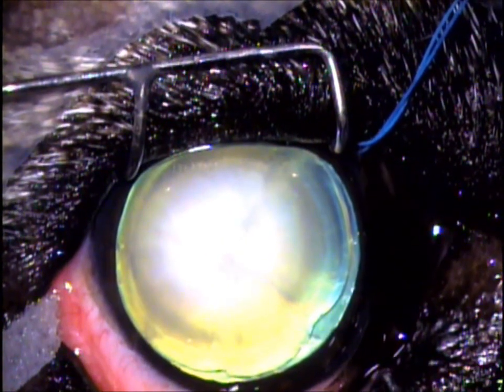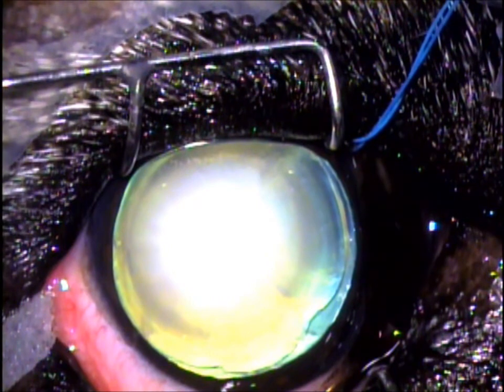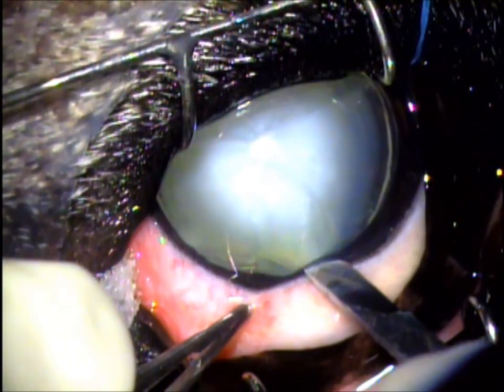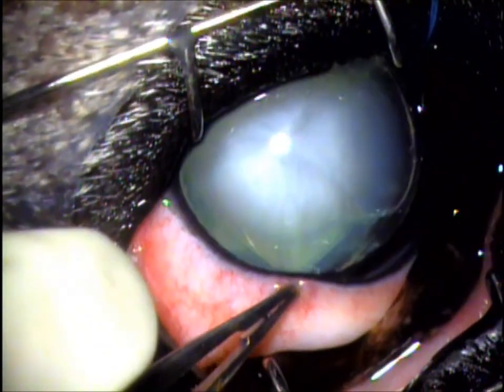This is Zsa Zsa's left eye positioned under an operating microscope, and you can see the cataract in the center of the eye — the large white opacity. Zsa Zsa's under anesthesia, so she's not feeling any of this. This is the initial incision, actually at the top of the eye if she was standing up, about three millimeters into the cornea.